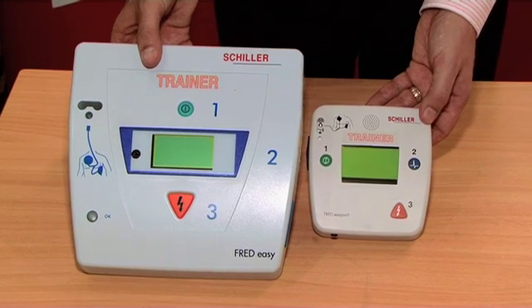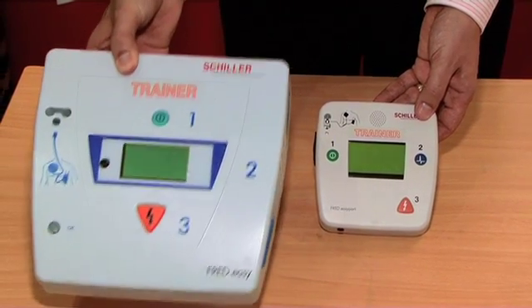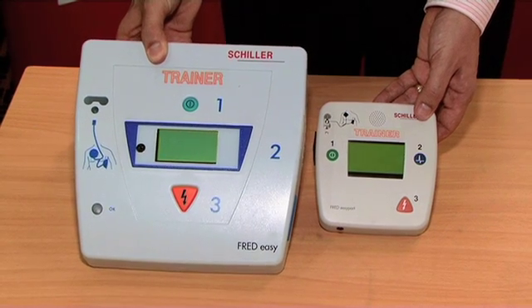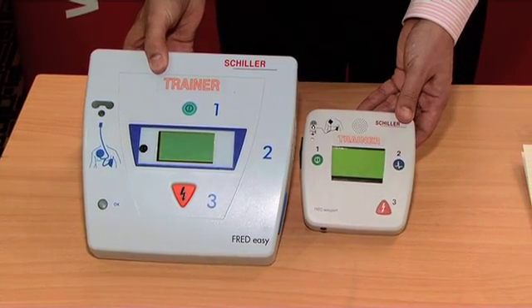It has an exceptional IP rating and can be used both indoors and outdoors. It's simple to use and is aimed at lay responders and also healthcare professionals. For comparison, you can see the difference between the Fred Easy defibrillator, a standard size defibrillator, and the Fred Easy Port, the smallest defibrillator in the world.